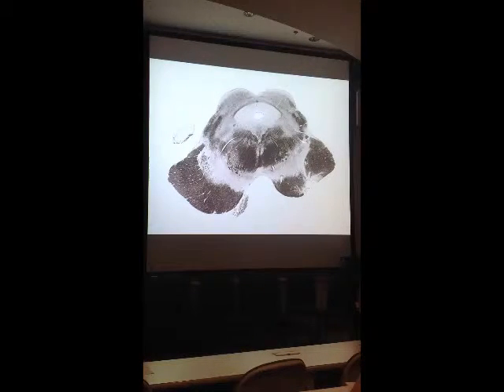Okay? It's possible I could ask you the position of a major ascending somatosensory pathway that dominates this area through here, and that would be what pathway? The medial lemniscus. Remember the cornucopia here, and the medial lemniscus is the white part of the basket. The tapering into the basket here, that's where the spinothalamic tract is. And again, I could ask you that, but that maybe gets a little bit off.